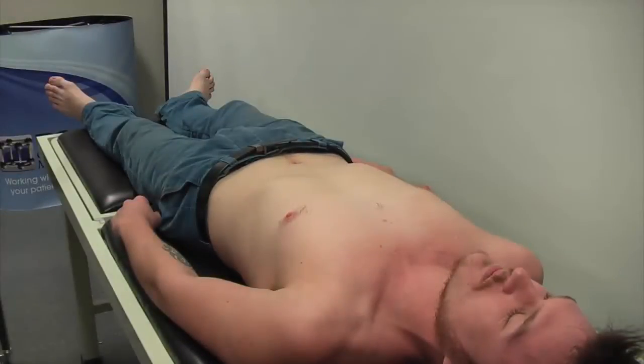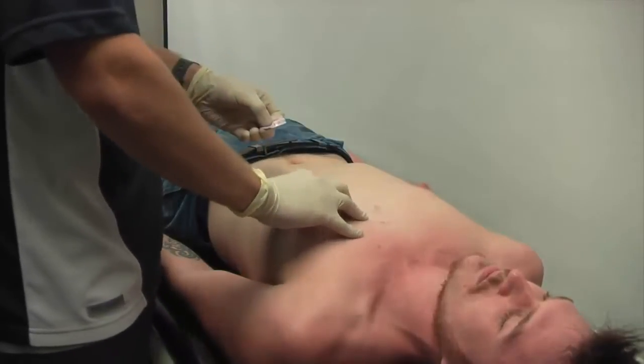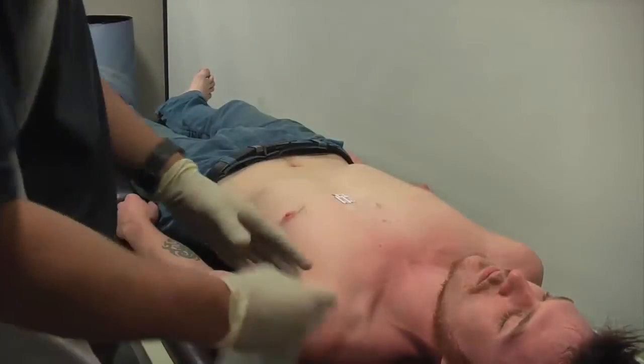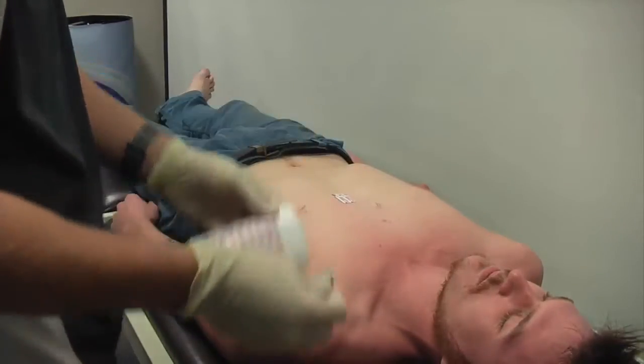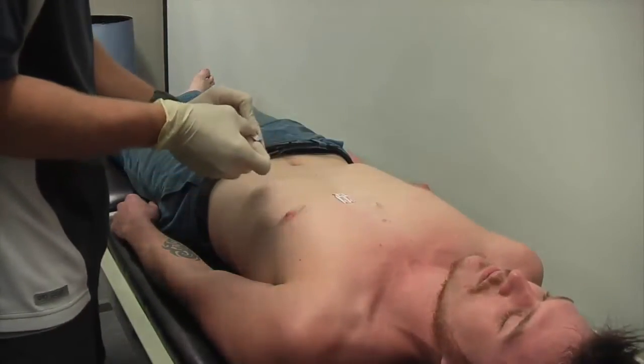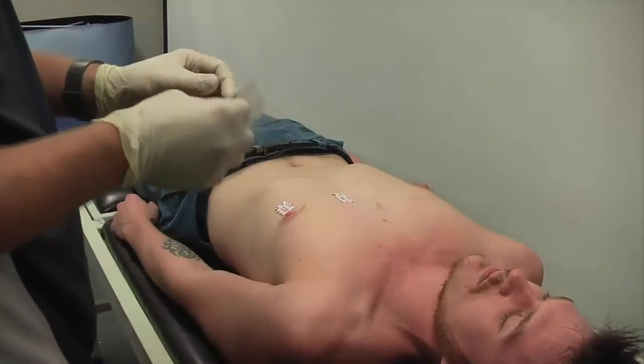This video demonstrates the difference in quality of an ECG trace when a patient has been prepped correctly compared to just slapping electrodes on. We're using electrodes that are cold, so they haven't been warmed up in someone's pocket. We're not trying to demonstrate correct ECG placement here — these are approximations — we're just looking to demonstrate the quality of trace achievable with correct patient preparation.